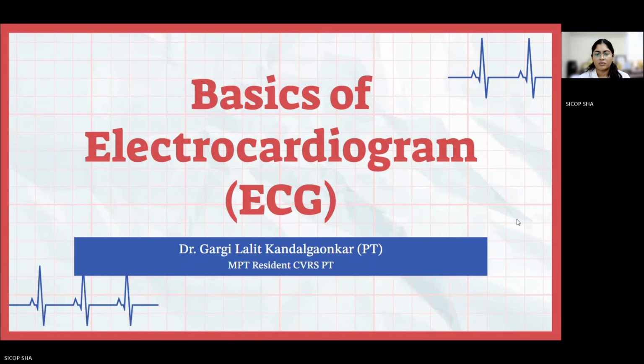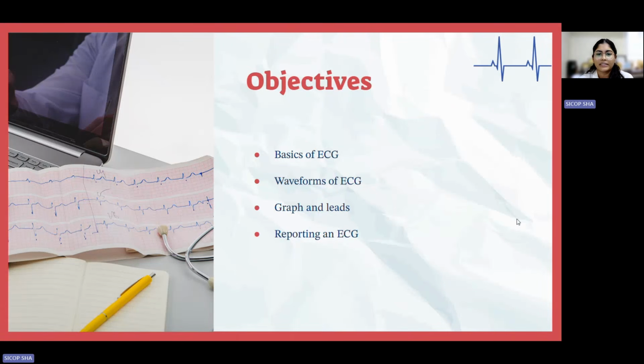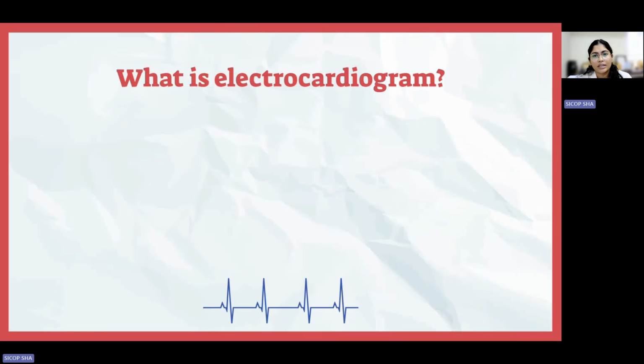Today I am going to talk about the basics of ECG. When we're talking about the basics of ECG, we'll be understanding the waveforms of ECG, the graphs and leads, and how to report an ECG. So what is an ECG?